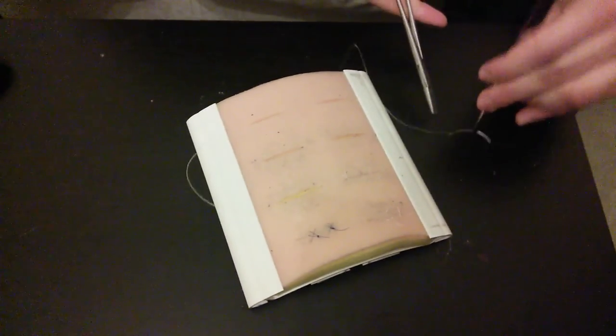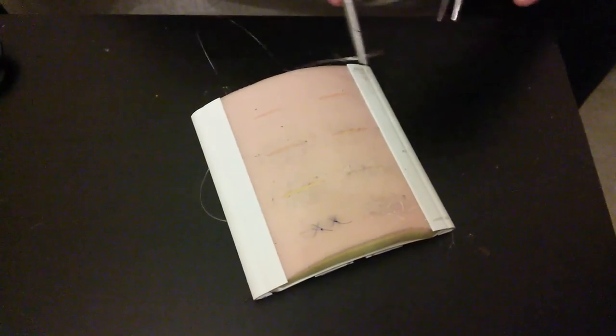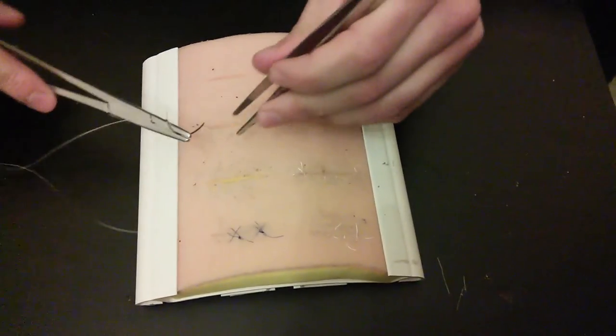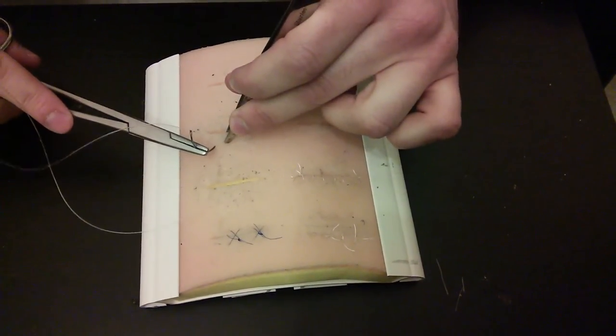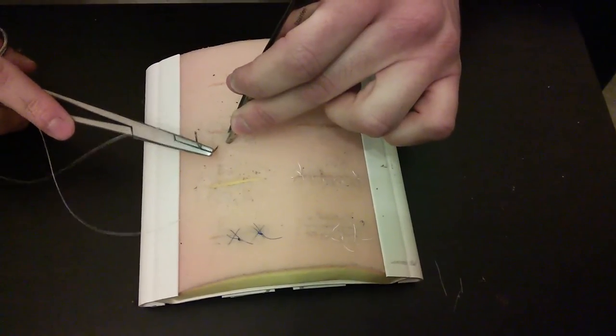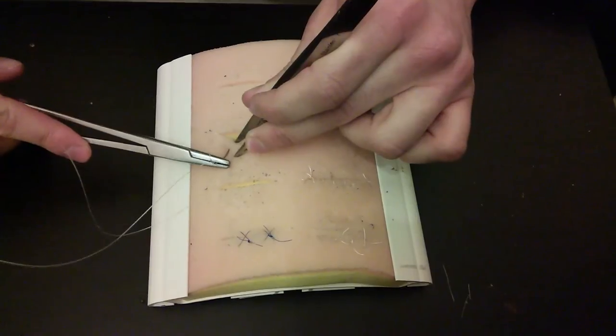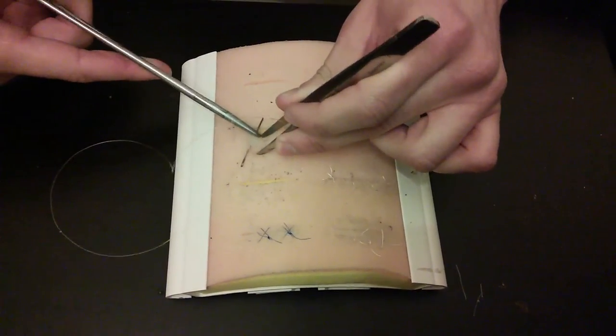Remember we cannot touch the needle with our hand, but we can with the forceps. Now that we have started it, we are going to start on the opposing side and take a bite about 5-8mm away. We are going to go through once and out again before the edge of the wound, and pull it through.